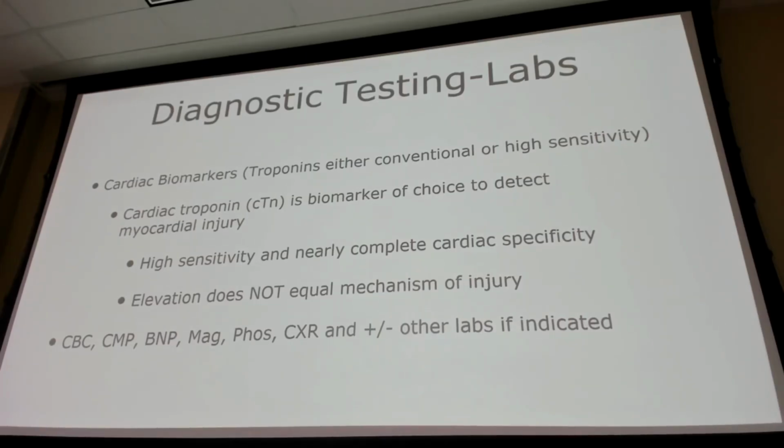Everybody gets a chest X-ray, and really we're trying to rule out other causes when we're getting that chest X-ray. So it's not going to help us or be indicative of any acute coronary syndrome, but it can identify whether maybe this pain is from a pneumonia. Maybe they're having heart failure.